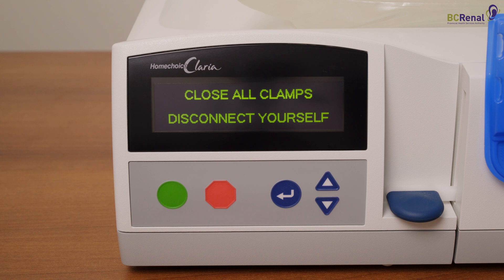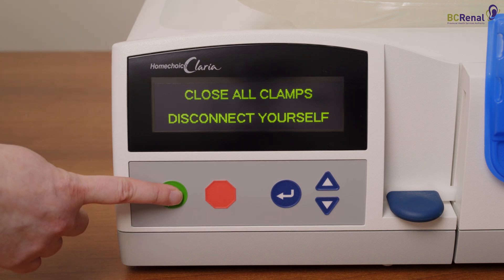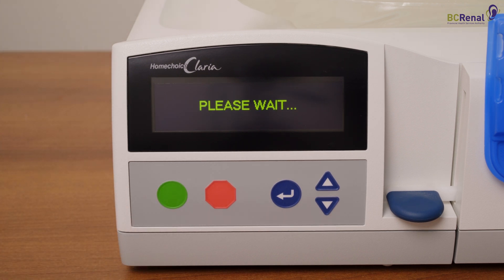After disconnecting from the Cycler, press the green button. The Cycler will say: remove the cassette.